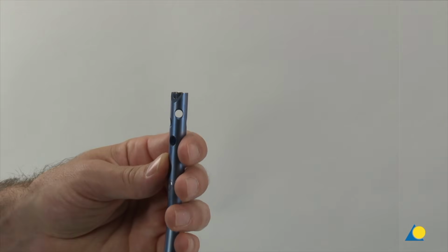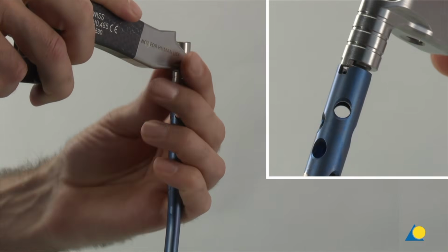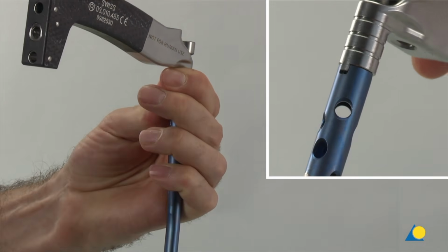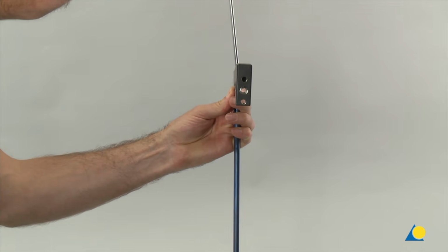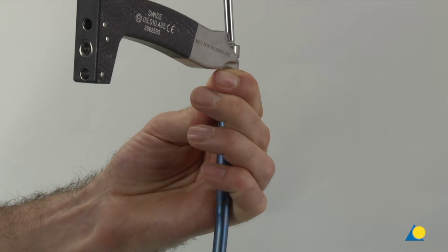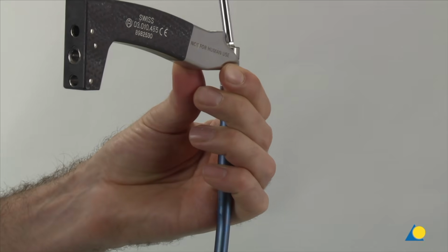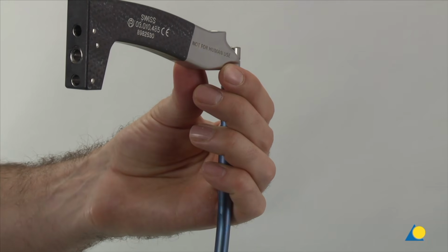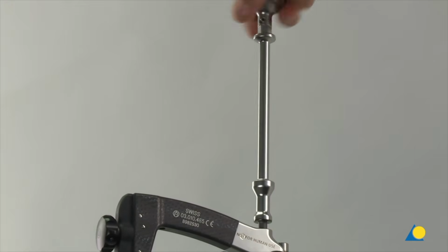The insertion handle should be oriented anteriorly with the tab on the handle matched to the notch on the nail. The connecting screw is placed through the insertion handle and threaded into the proximal end of the nail with the hexagonal screwdriver. After verifying that the nail is properly oriented on the insertion handle, the assembly is secured and tightened. The driving cap with thread is threaded into the insertion handle.